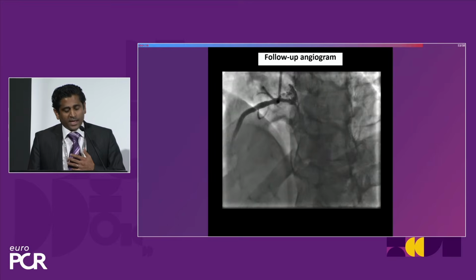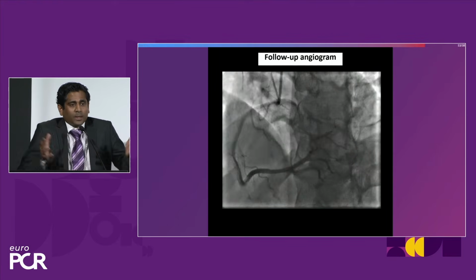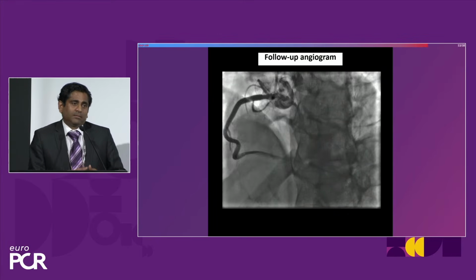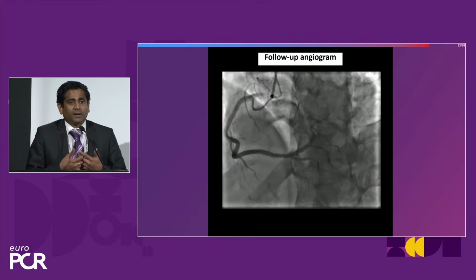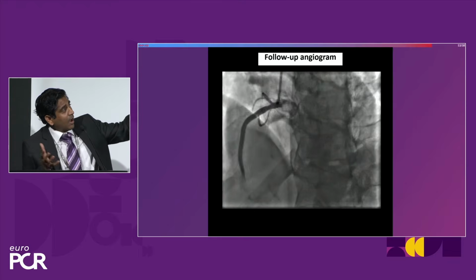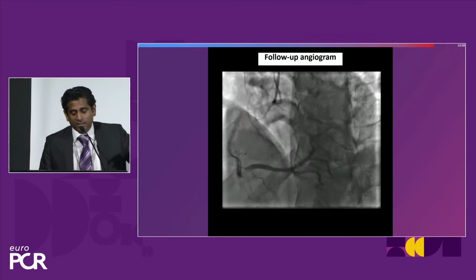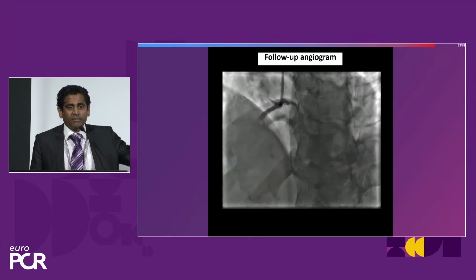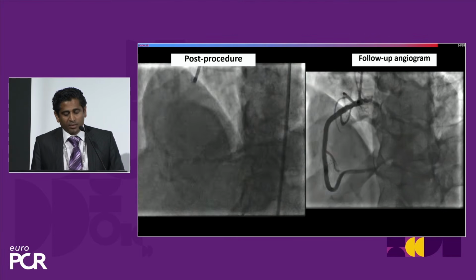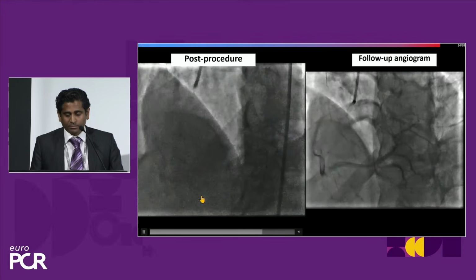So the patient came back for a check angiogram, and you could see we can't even find where the lesion is. And more importantly, look at the way the artery contracts. It's almost like when we say that the DCBs, like maybe BVS, preserve the arterial anatomy or the vasomotion, you could see the classic example, how the artery contracts so nicely. If I had put a stent, I would have caged the whole vessel. I don't know whether it makes a clinical difference, but visually it looks very nice. So that's the follow-up angiogram and the post-procedure. You can see the artery has grown. So clearly the caliber would have been underestimated if I had put a stent in.